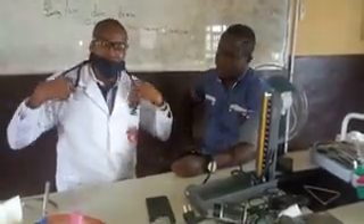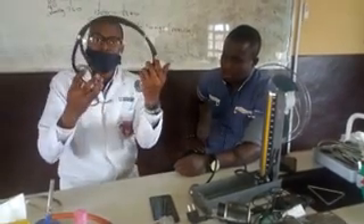It is very simple. Using the sphygmomanometer alongside the stethoscope, you can easily check arterial blood pressure. Thank you.